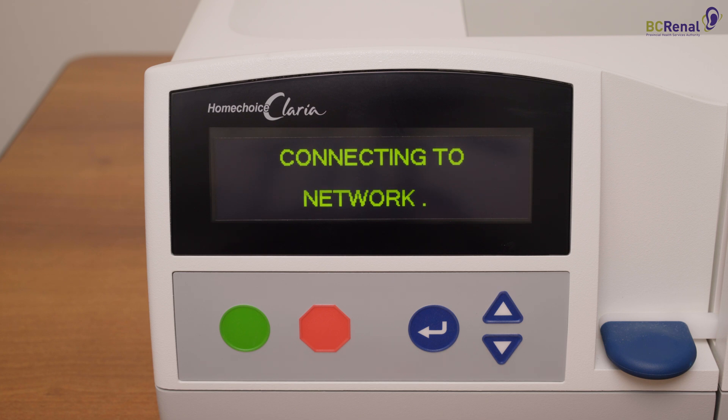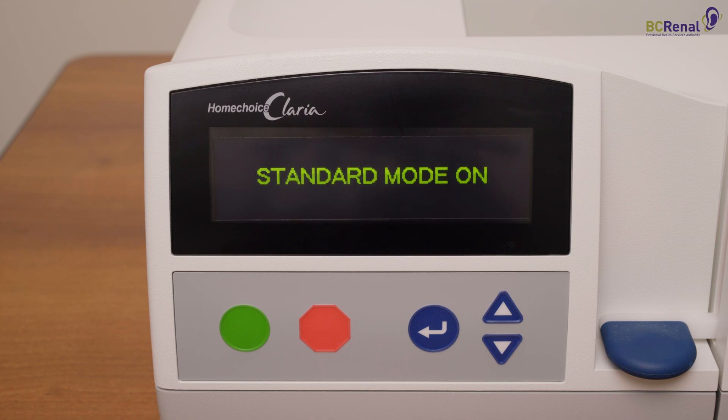The message 'confirm configurations' appears if the system detects new therapy settings in the ShareSource platform. The system may prompt you to enter additional information, such as weight and blood pressure. When all data is entered, press the red button.